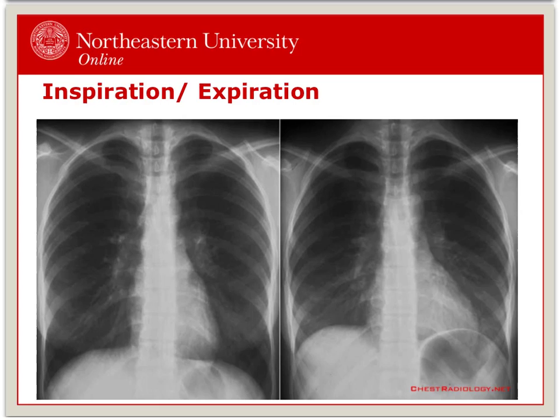All PA chest films are taken in the inspiration view. An expiration view may be ordered for comparison. In the inspiration view, in a healthy adult, 10 pairs of ribs will be exposed because the diaphragm moves inferiorly. This will also lengthen the heart and lungs as they are pulled down by the diaphragm. The diaphragm has moved inferiorly and the lateral chest walls appear flattened.